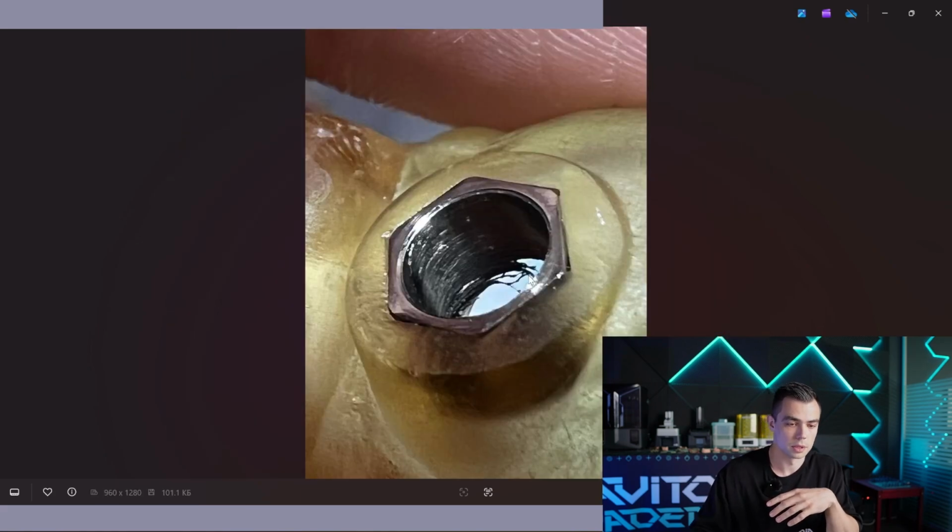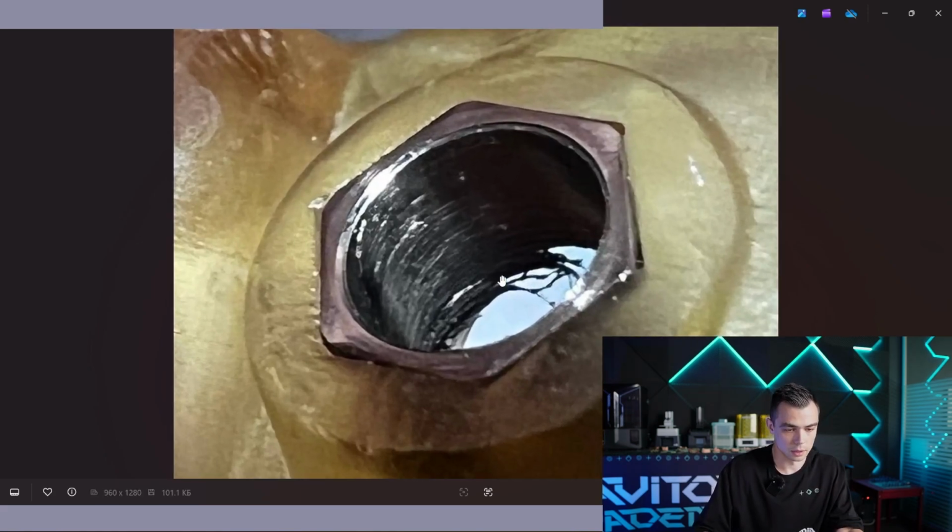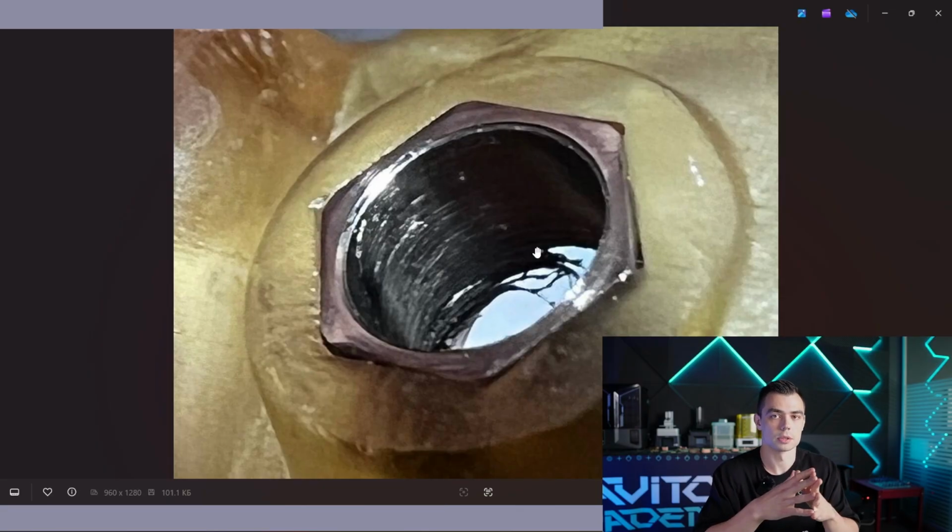It was really not good to see during the surgery, and that zone was overheated, and that was because of two mistakes.